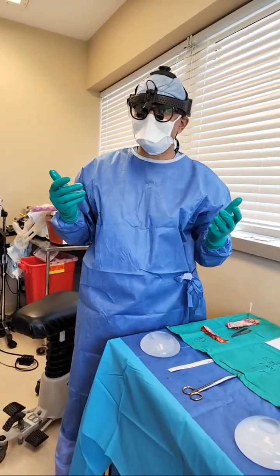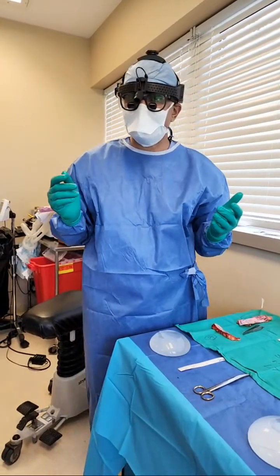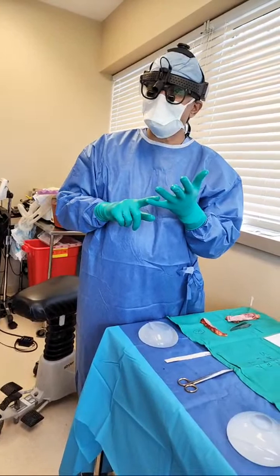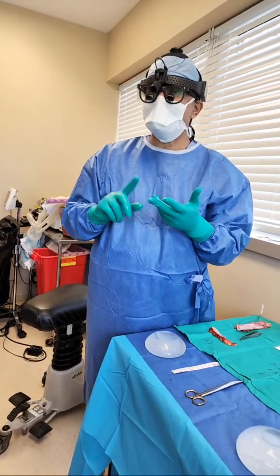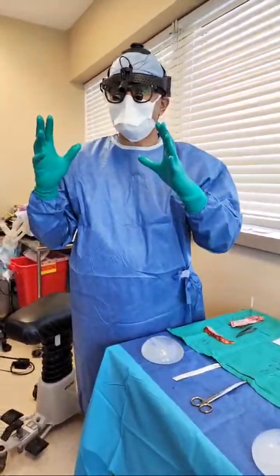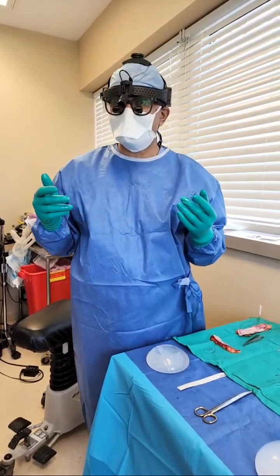As you heard, I presented at the international conference, and this is how I feel strongly it needs to be done. Post-op, when we look back, we have done a complete detailed analysis as to what the tissue was and what it was not, and cultures are done, and the patient is free and void. The patient has the peace of mind that all of that capsule was removed, because that is the whole essence of explant surgery.